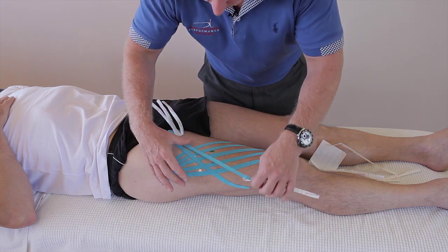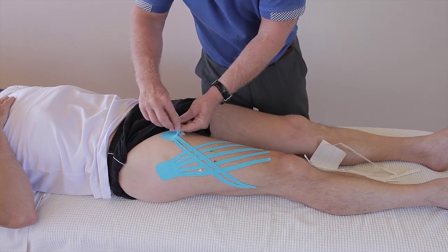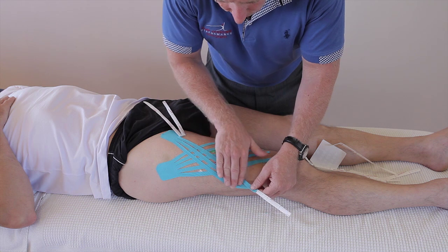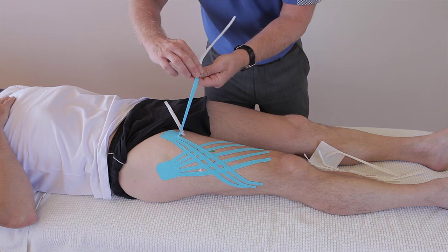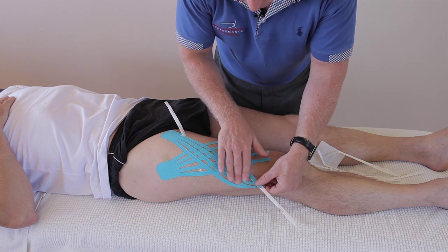I'd definitely leave this on for three to five days, if not longer — probably no longer than five. Also, the ends of the tape I've rounded off, because when you put your trousers on and off it tends to lift the tape, so you notice the ends are just rounded.